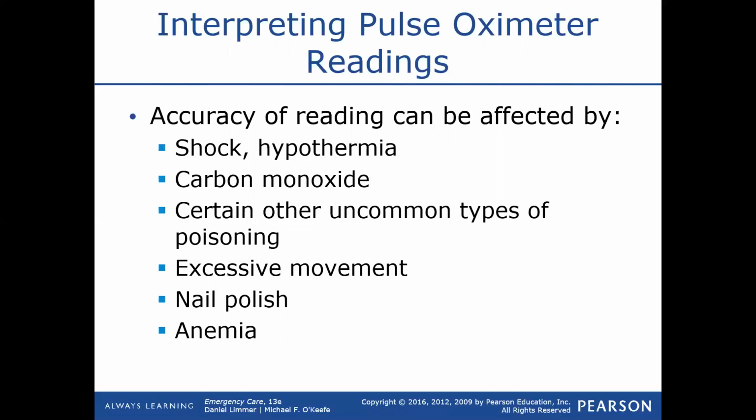Some real fancy pulse oximeters have an SpCO rating on them. That can actually differentiate between the two, and it can say how high your carbon monoxide levels are. Now, most of us, especially smokers, but anybody really, has a certain amount of carbon monoxide running through their blood at any time. I think, don't quote me on the exact numbers, but if it's below 8 on the SpCO, it's considered normal. A smoker can get up to like 11 or 12. So the point is, we all have a little bit of carbon monoxide running around in our bodies at any point.